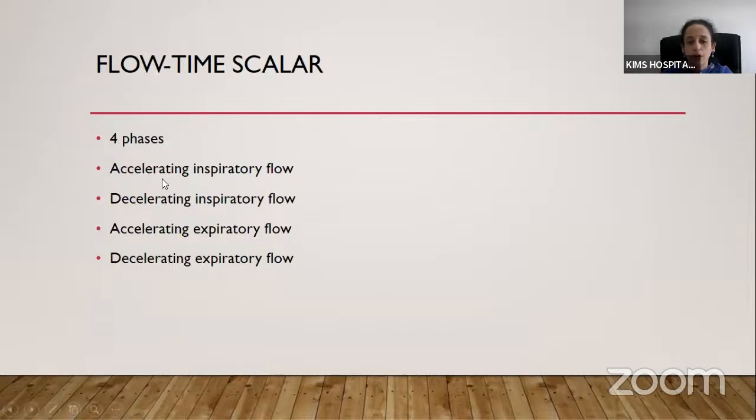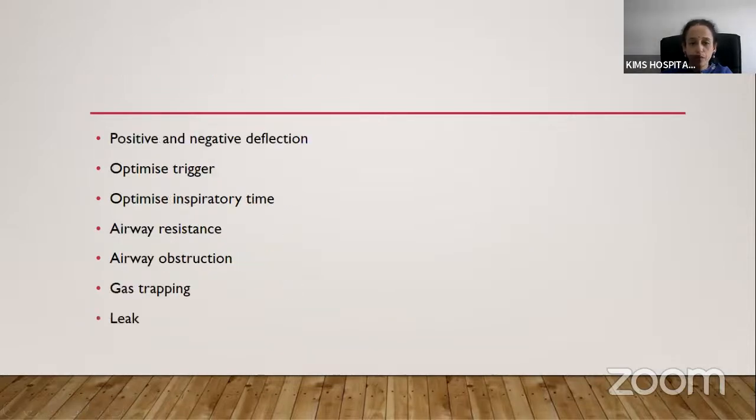Now, there will be 4 phases as I already told you: accelerating inspiratory flow, decelerating inspiratory flow, accelerating expiratory flow, and decelerating expiratory flow. So it will be biphasic. There will be both positive and negative deflection.